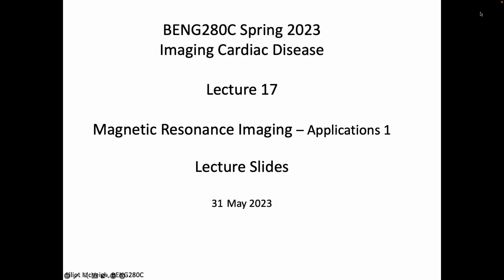Another thing you can do is just take data all the time, right? Just continuously take data and then retrospectively go back and partially reconstruct images from short sequences of data. They're not going to be great pictures, but they're good enough to tell you where the patient was in their breathing cycle and where the patient is in their cardiac cycle. And so now you can label all of your data as to where it occurred in the cardiac and breathing plane, because you've got on one axis the breathing cycle, on the other axis the ECG or the R to R intervals. So you can map all of the echoes you've taken, put them in that plane, and then just pick a group and make the best picture you can from some segment of that plane.